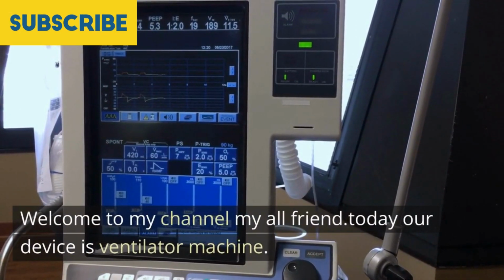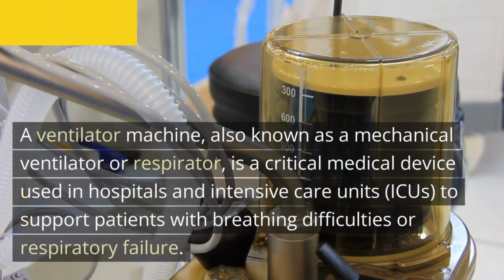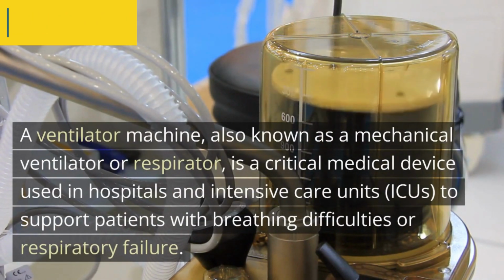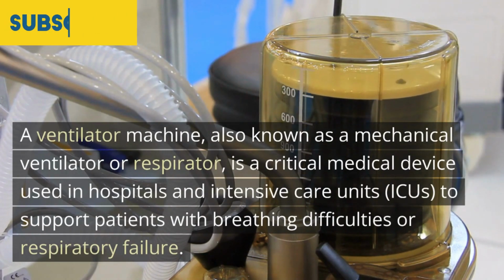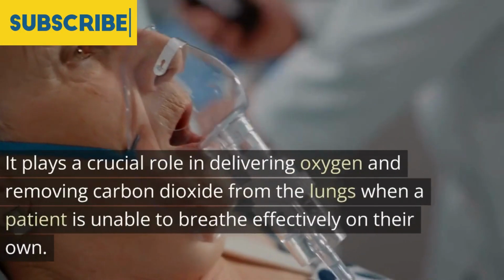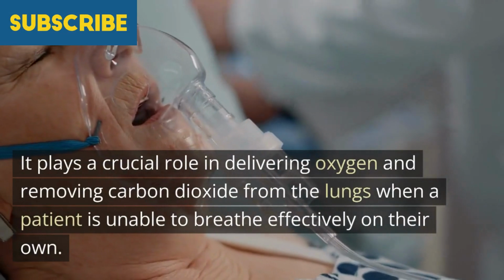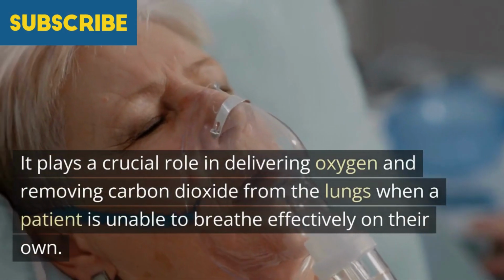Today our device is the ventilator machine. A ventilator machine, also known as a mechanical ventilator or respirator, is a critical medical device used in hospitals and intensive care units, ICUs, to support patients with breathing difficulties or respiratory failure. It plays a crucial role in delivering oxygen and removing carbon dioxide from the lungs when a patient is unable to breathe effectively on their own.